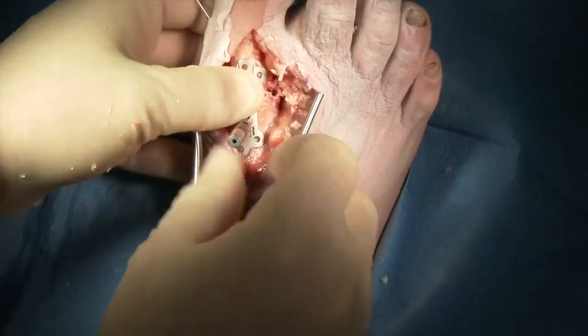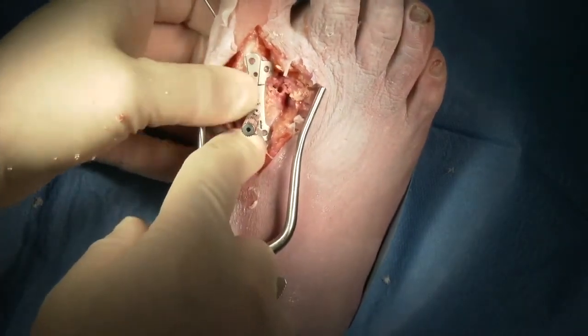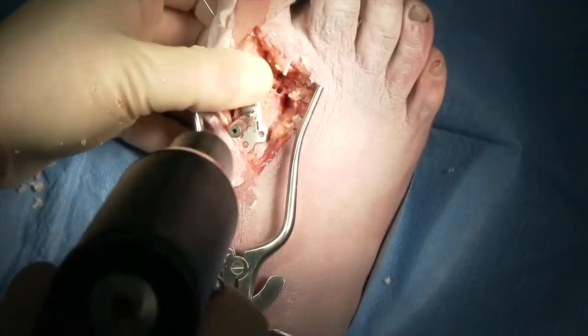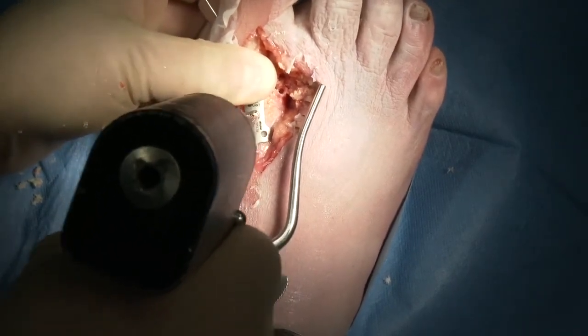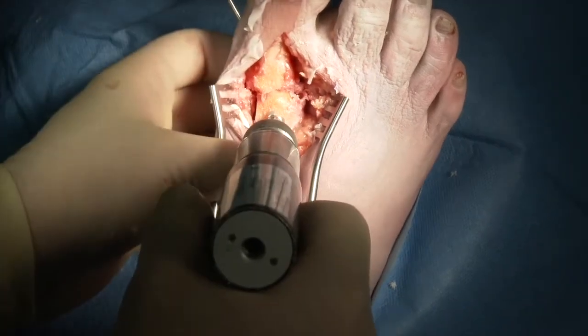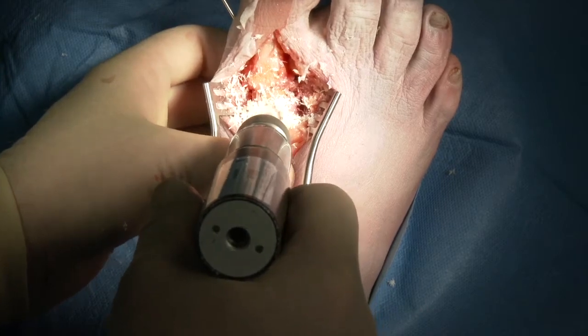This allows us to hold the joint in the proper position for application of the template. Once we place our template, the laser mark goes at the level of the joint. We'll be able to place our guide wire for our CP reamer, and this assures that the recess for the CP plate will be in the appropriate position relative to the joint itself. We'll then over-ream that guide wire to create the pocket recess for our CP plate.